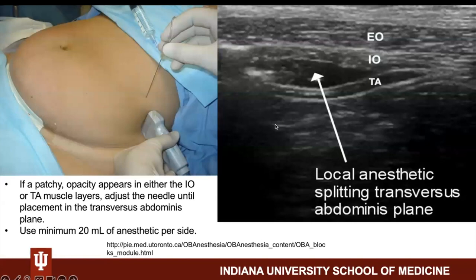After confirmation, switch to the anesthetic and administer at minimum 20 milliliters, while continuing to advance the needle as the planes open up. Once this is done, repeat on the other side.